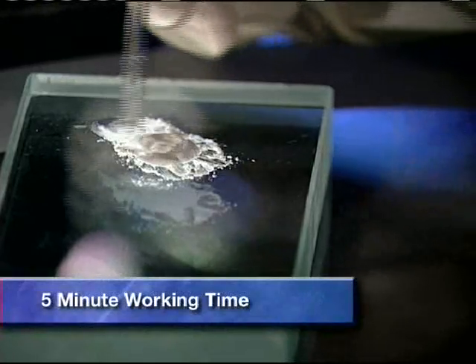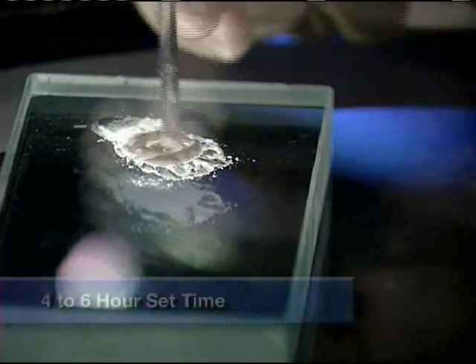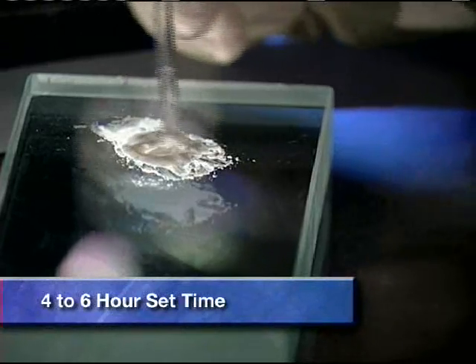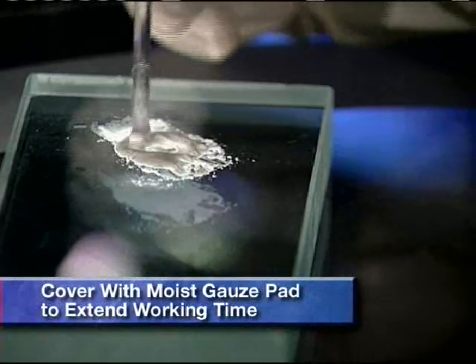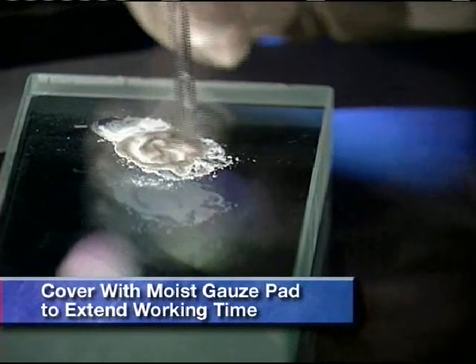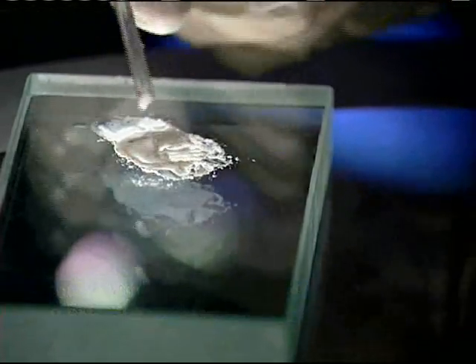The working time is about five minutes and the material will set gradually over a four to six hour period. If you desire a longer working time, cover the mixture with a moist gauze pad to prevent evaporation.